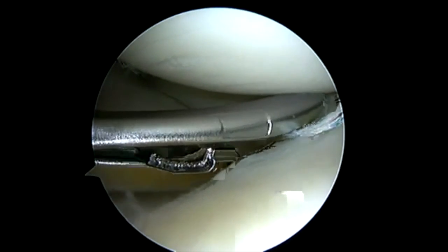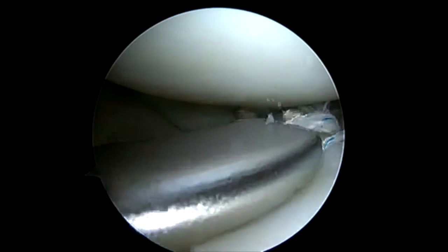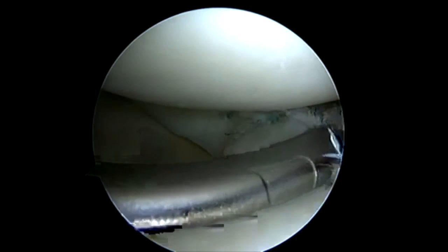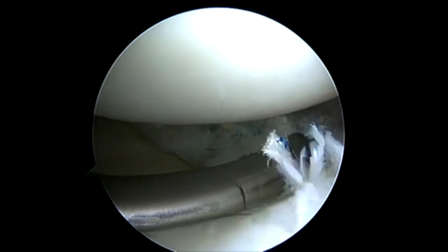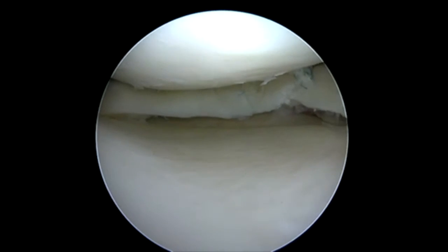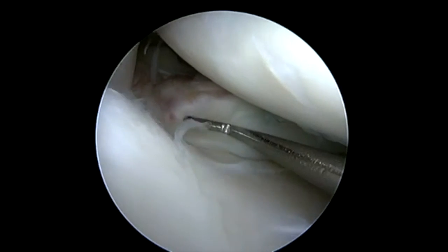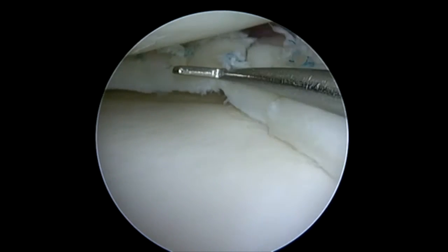Here we've got our lower jaw extended. We're going to come up and in and grasp that meniscus and hold on to it so that it doesn't spit like a watermelon seed from our jaw. Once we've got a nice firm grip, we'll pass that second suture and then retrieve our tails and go ahead and tie. This gives us a nice anatomic repair of a flipped bucket handle tear of the medial meniscus with our all-inside technique.